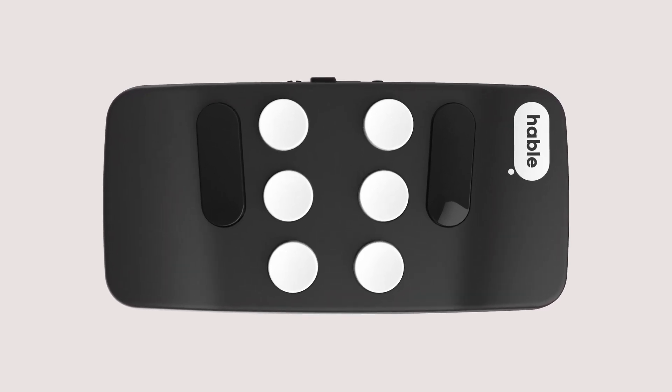First, hold the Hable 1 in the right position by holding it with the power switch pointing up and the buttons facing away from you. Once you've got a firm grip, slide the power switch to the right and you will feel two vibrations, signaling that your Hable 1 is in pairing mode.